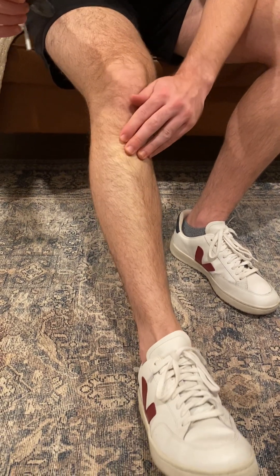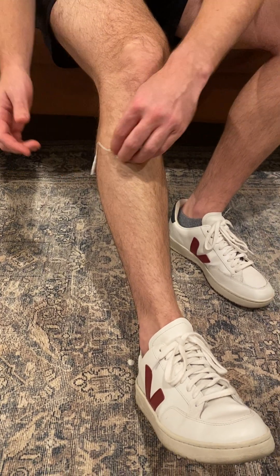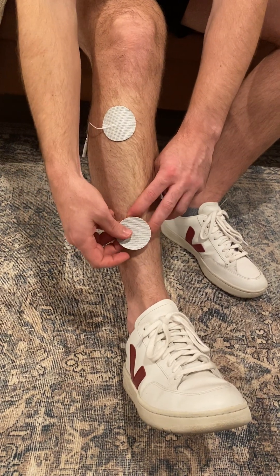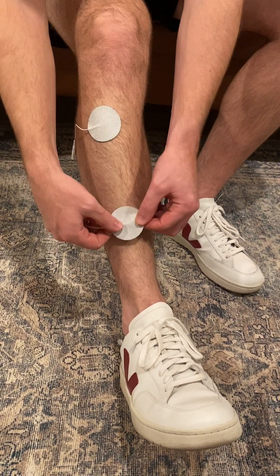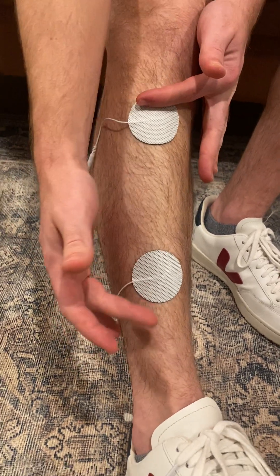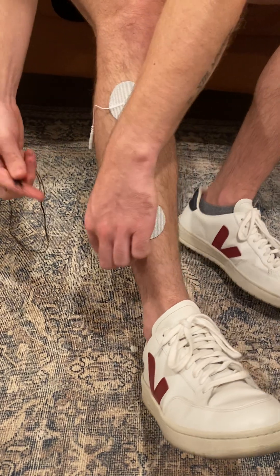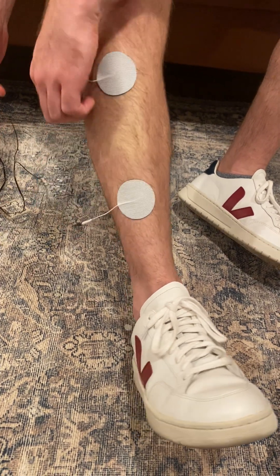Because this is a smaller muscle, it can be challenging to get the appropriate pad placement. Sometimes you'll start getting other muscles recruited that you're not meaning to, so you're going to have to adjust the pads accordingly based on what you're seeing the foot do. I'm going to place them right about here to start — we'll see if that works. You don't want them too far apart or the electrical signal is going to diminish between the pads and not be as strong. But you also don't want them too close because then it's going to be extra strong and painful for the patient, and you're not going to be hitting as many muscle fibers.